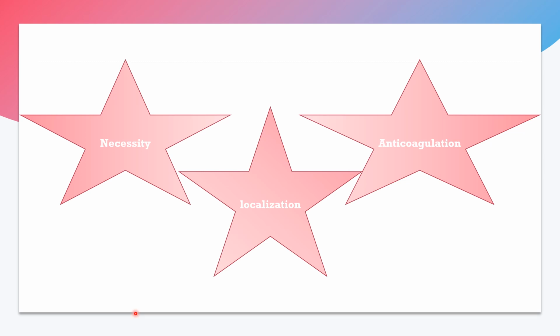Patient on ECMO, and we need to do a procedure. So we have three questions to answer. Is it necessary? Where will we do it? And what about anticoagulation for this patient?